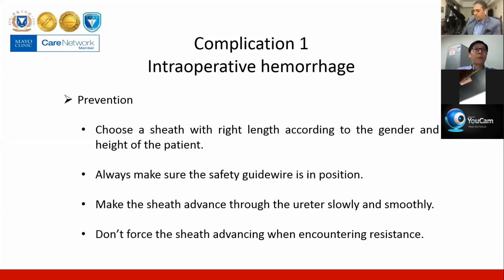And sometimes the patient's breath will make the kidney move up and down regularly, and this situation will increase the incidence of injury when we do Holmium laser. So we should follow the rhythm of the breath, and of course we also can ask the anesthetist to reduce the breathing rate if the patient is in general anesthesia and the breath is controlled by the ventilator.